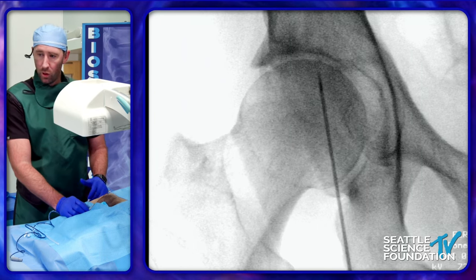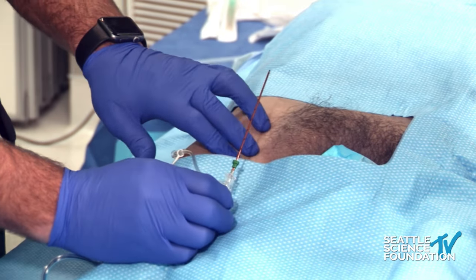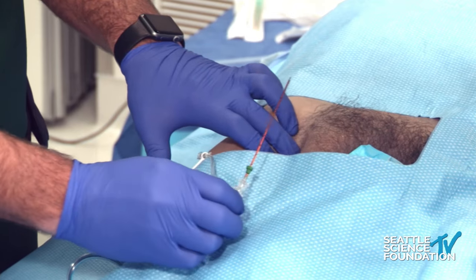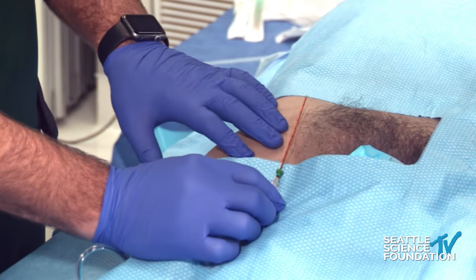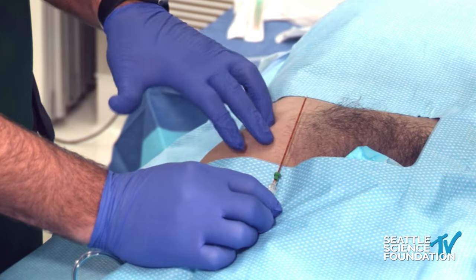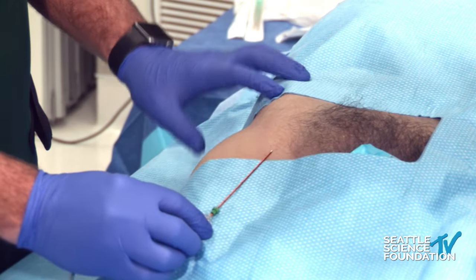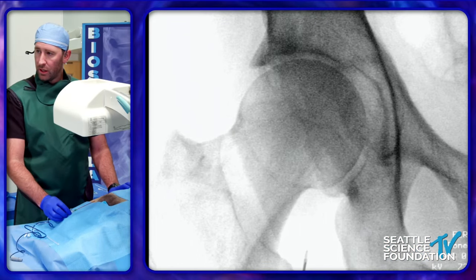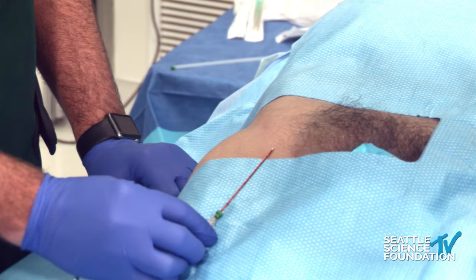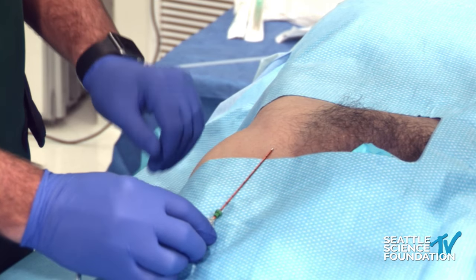There are a couple of ways to avoid the femoral vascular bundle. You can palpate the femoral artery, feel it, go about two centimeters lateral, and that's your entry point. You also have the option of using ultrasound to confirm where the artery and vein are and direct your needle under them. We know the femoral artery is about one to three centimeters below the surface depending on body habitus. Coming in a little lateral, palpating, and entering there — as you go a little bit deeper you are under the femoral artery and vein and avoiding it.